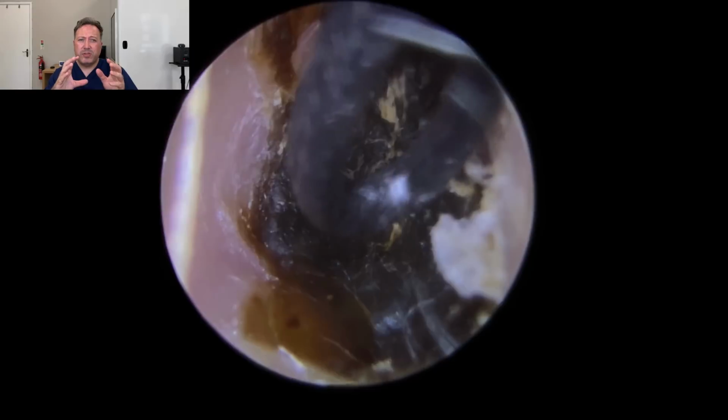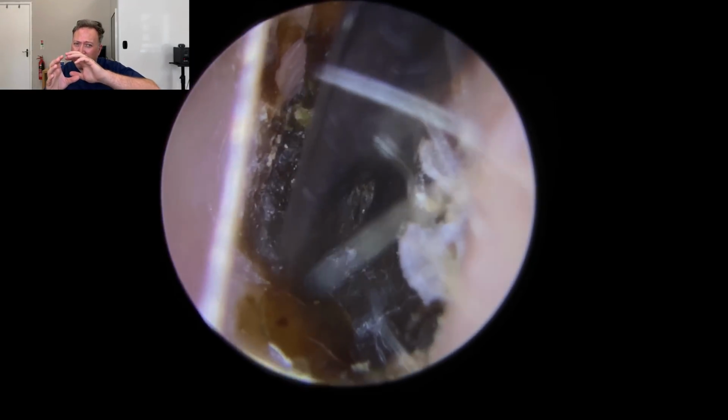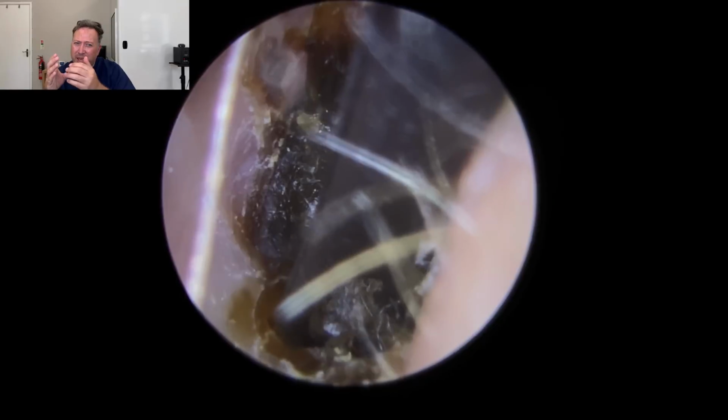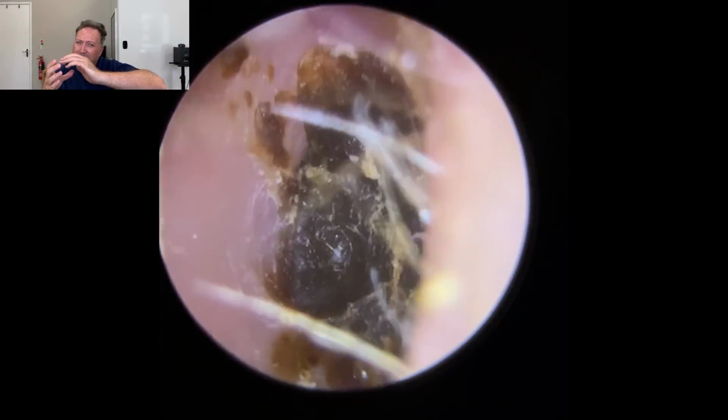So I'm opting to use the Jobson horn here. It's deep and we've got to be really careful. I'm just trying to break an edge. If I can just nip a little bit off the edge there, as we're doing, you can see it just coming away there just at the bottom edge. It will help me to lift this section here and just be able to get behind.